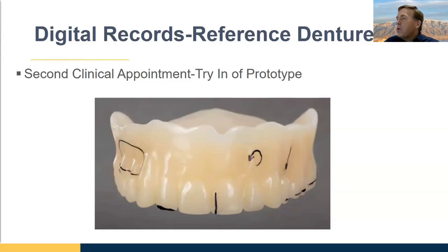These prototypes are also strong enough for the patient to wear, so you could send them home for a few days as a test drive to see how it works. As you can see here, you can mark on it, you can grind on it, you can add to it, whatever you want to do. Let your laboratory know what changes you've made, so that they can be sure to scan it in as a reference.